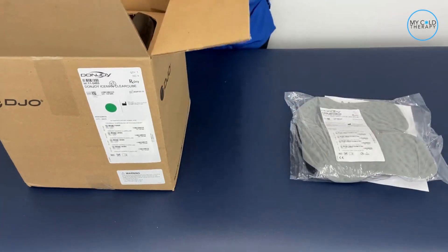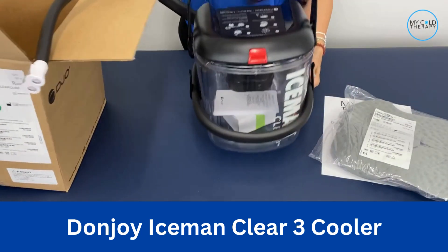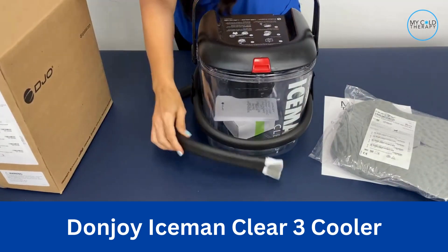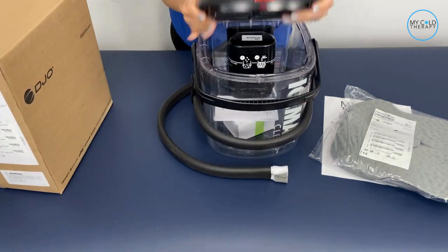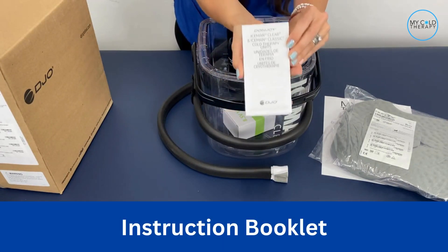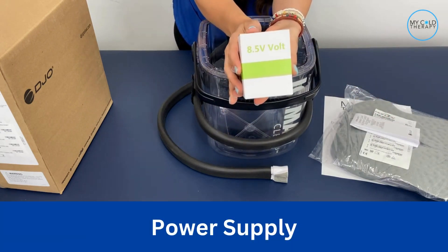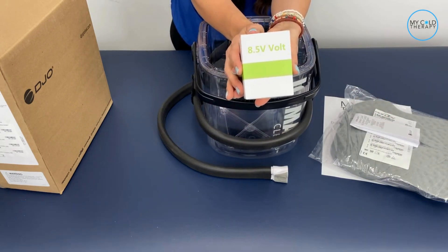Once you've made sure that's there, you're ready to take out the cooler. Here is the DonJoy Iceman Clear 3, and inside you're going to find an instruction booklet which tells you how to use it, and you're also going to find your power supply.